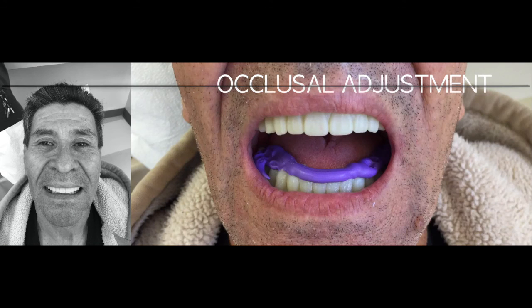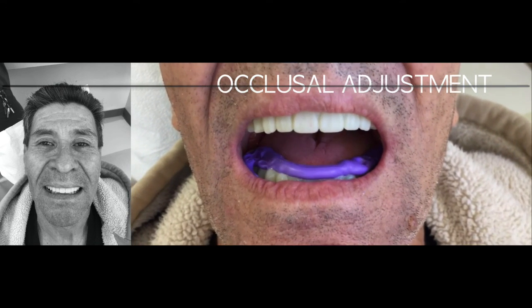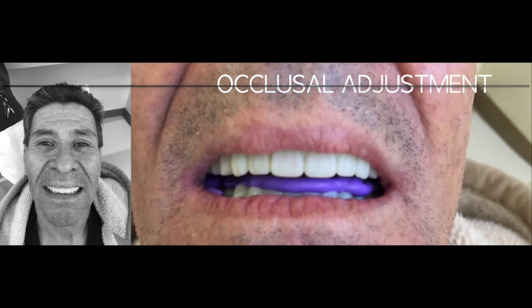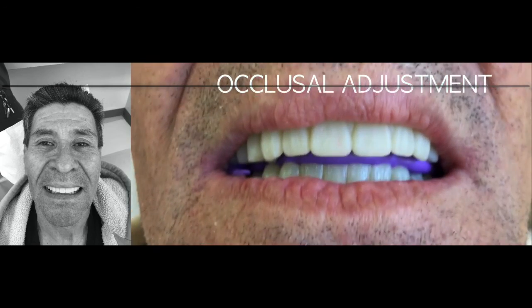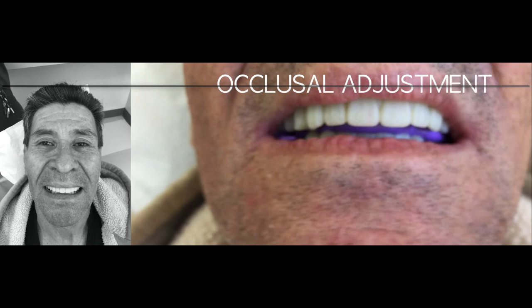When there is an occlusal discrepancy, you need to take a new bite registration intraorally so that you can adjust in the articulator when needed. So in this particular denture try-in, we identified an occlusal discrepancy. Therefore, we took the bite registration.